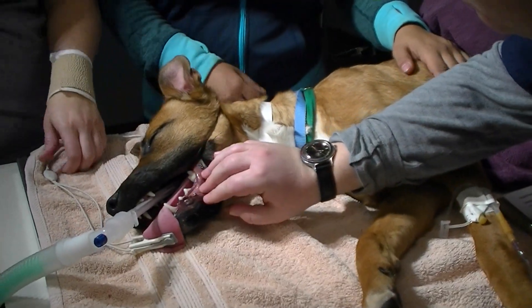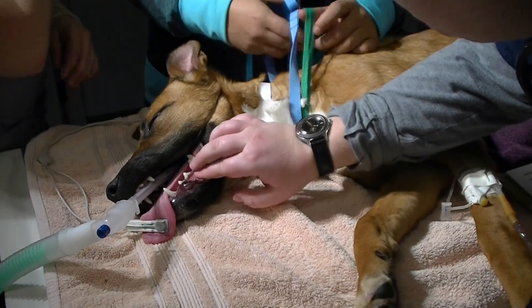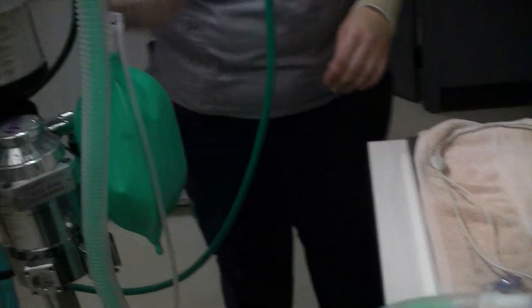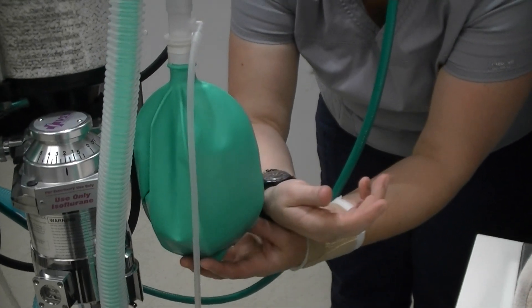Her fluids are still running. Do you have a respiratory rate? We have 48 for respiratory rate.